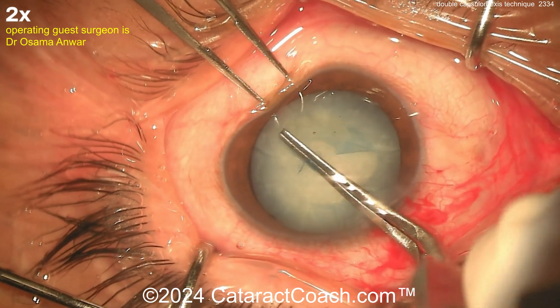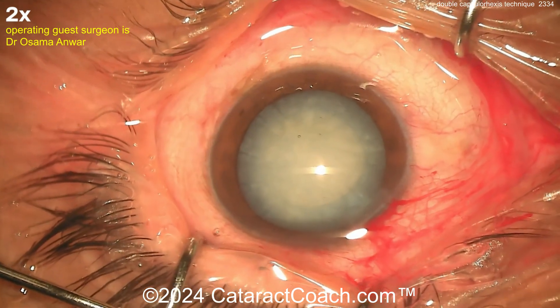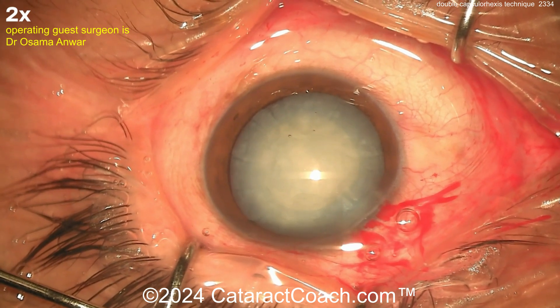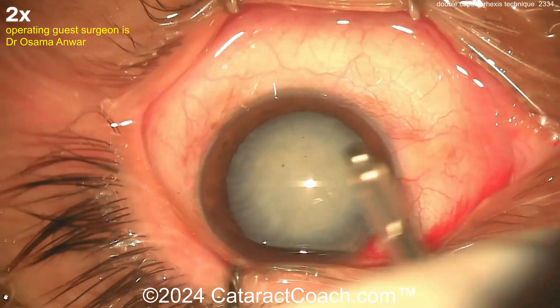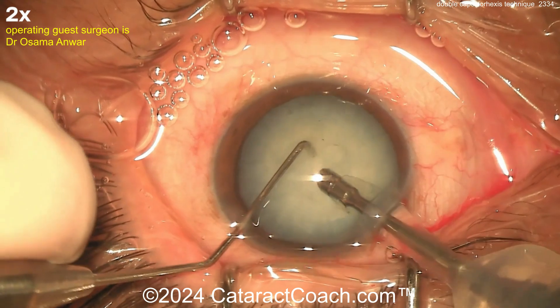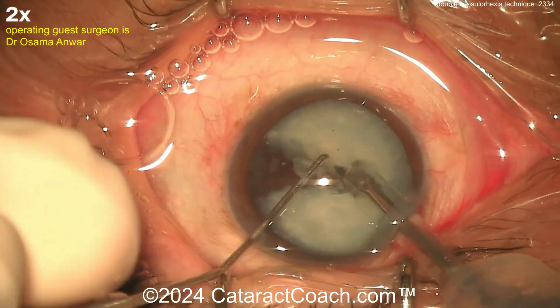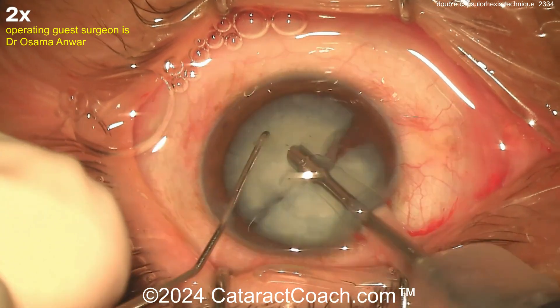This is just the best way of doing it for most people — just do the double rhexis technique, some sort of way to decompress the capsular bag. Remember, liquefied lens material is not only in front of the nucleus, between the anterior lens capsule and the nucleus, but it's also behind the nucleus, between the nucleus and the posterior lens capsule. So you want to rock the nucleus around or go inside the capsular bag with a Simcoe or BSS cannula or IA probe — something to really just decompress and get that liquefied lens material out.